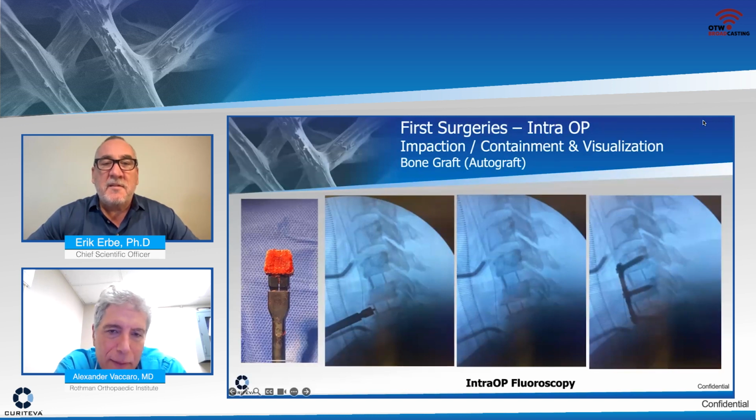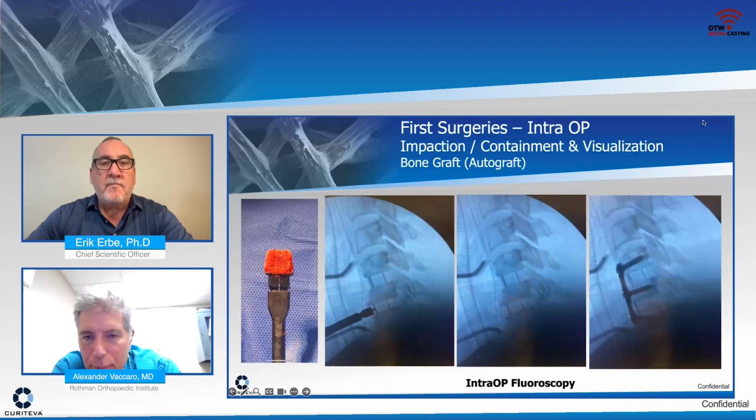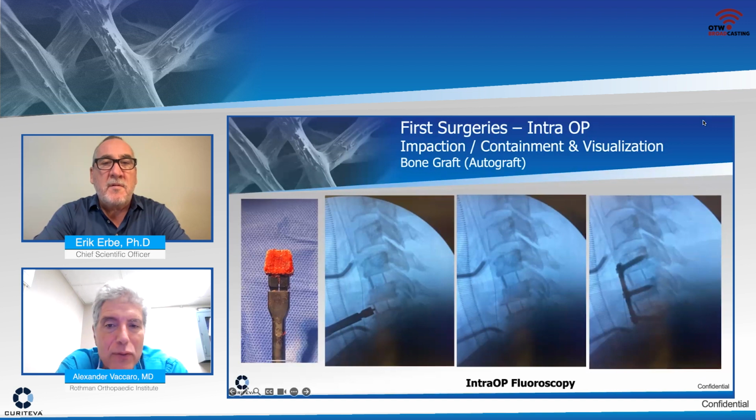Now you can see, look at the color of the vertebral body above and below, and look at the implant. You can see right through the implant. You have a perfect corridor. So over time, and you can see the size of the implant, it really maximizes the surface. So number one, that prosthesis is going to minimize any type of settling.